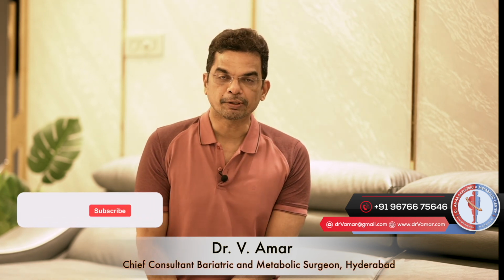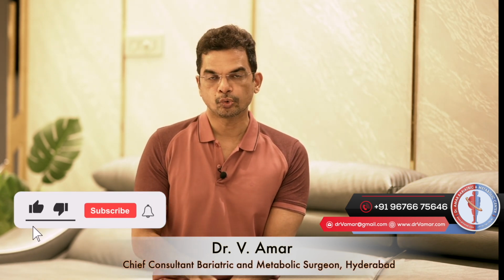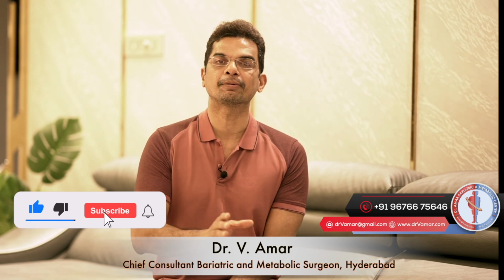Balloon insertion, whether it is a swallowable balloon or any other intragastric balloon, causes weight loss by food restriction. But the total body fat is controlled by more than 200 hormones which set a value for fat storage. And these hormones are not changed with balloon insertion. So, even if anyone loses weight, once the balloon is removed, 99% of the people will regain weight. So, balloon insertion is always for a temporary weight loss.